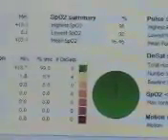But this could also be used to convince someone that they need it. They've got to have a study, and they might not believe they've got a problem. But if you put the pulse oximeter on them in the daytime, and they can't lower it, and yet you're showing that it goes under 90, they know what their body's going through. And that might convince them to do it.